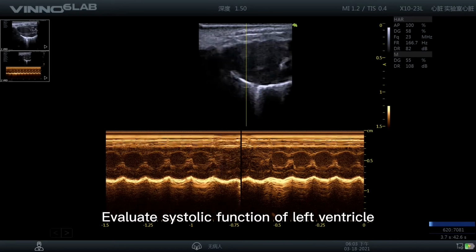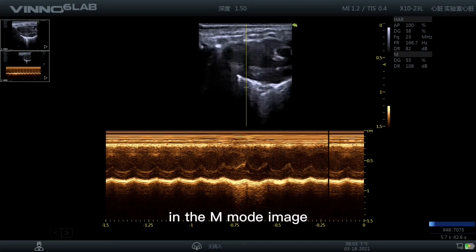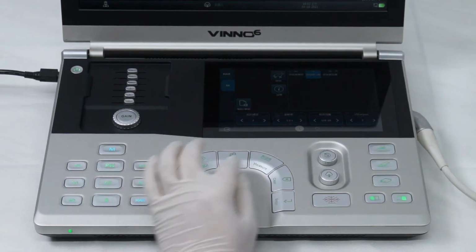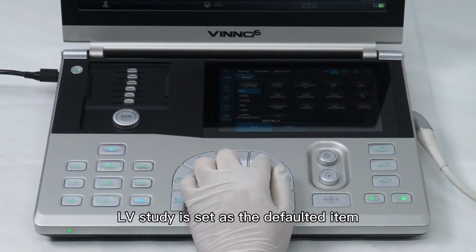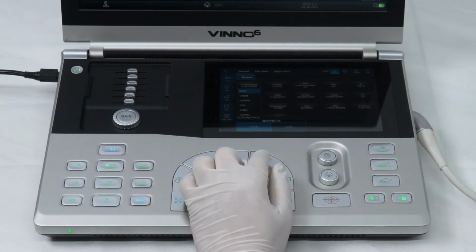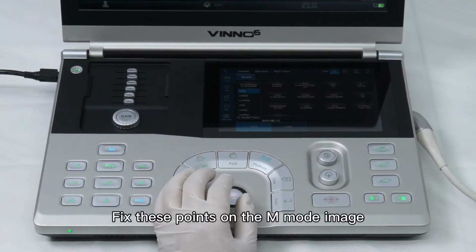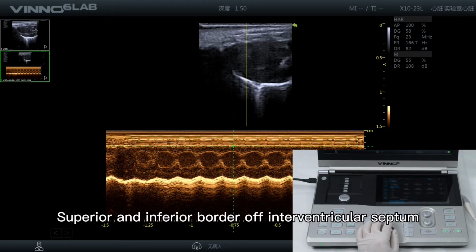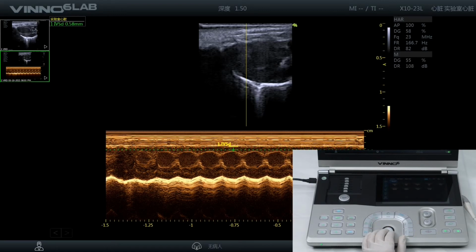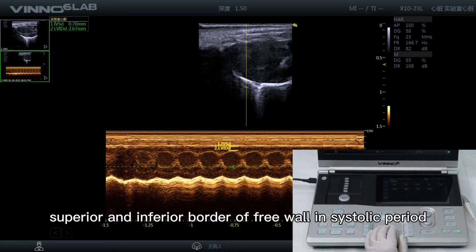Evaluate systolic function of left ventricle in the M mode image. Press measure button. LV study is set as the default item. Fix these points on the M mode image. Superior and inferior border of interventricular septum. Superior and inferior border of free wall in systolic period.